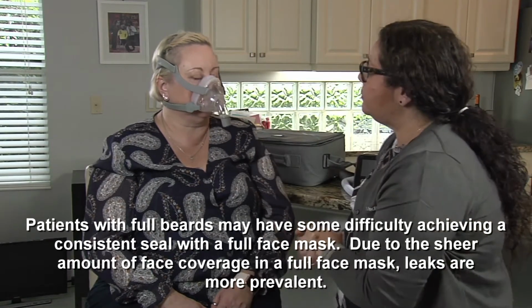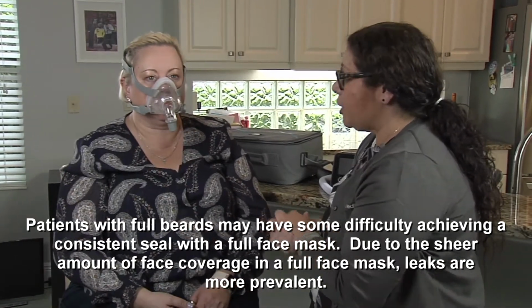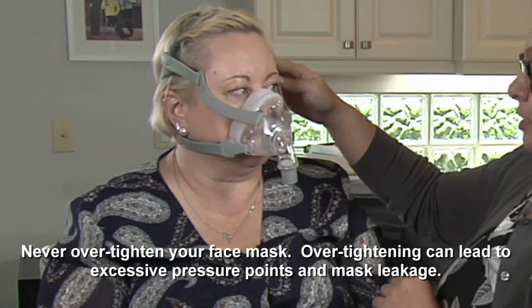How does that feel? Good. Do you feel like it's pinching or placing pressure on your face anywhere? Always remember, with any CPAP mask, over-tightening your straps can cause pressure points and excessive leak. I'm gonna go ahead and connect your CPAP so you can feel the pressure.